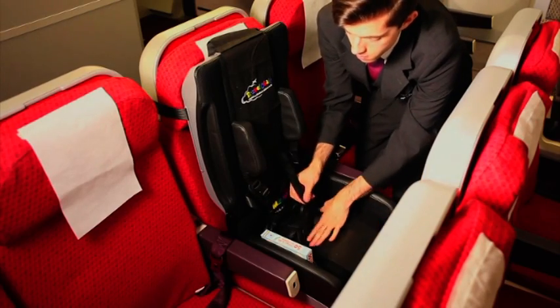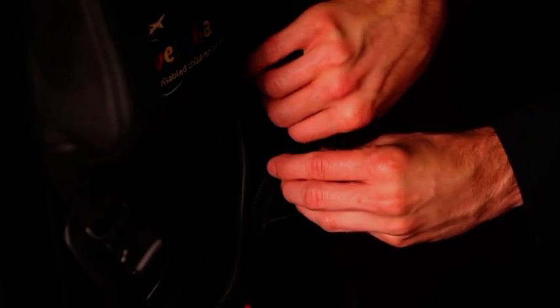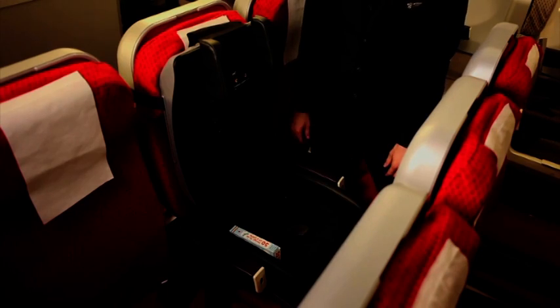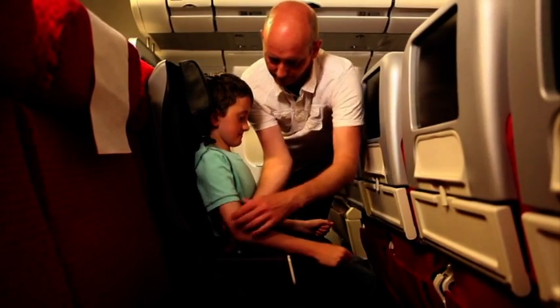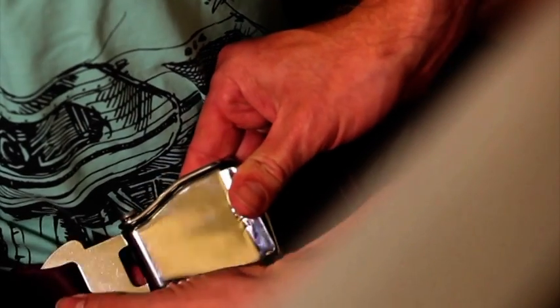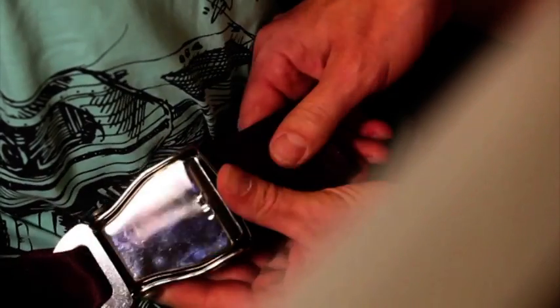Raise the crotch strap and pad and pass these through the hole in the seat cover. Unclip the two shoulder buckles, which can be found just below the headrest. Unclip one side buckle and ensure that the crotch strap is brought forward. The Travel Chair is now ready for the child. The child must be placed into the Travel Chair and made secure by the parents or carers. Next, fasten the aircraft seat belt and adjust as required.